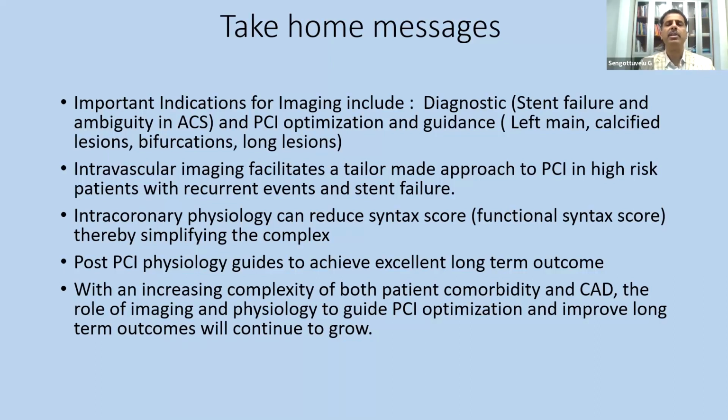It's also helpful in stent failure, both in stent thrombosis and ISR. It's useful in diagnosis, particularly in left main, and imaging is very useful to assess any ambiguous or borderline lesion, and it can help to reduce the SYNTAX score. Complex lesions can be made more simple.